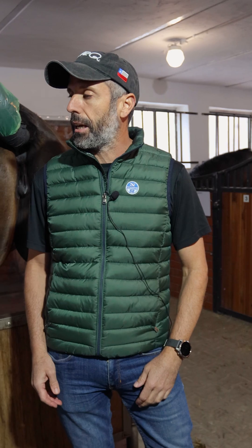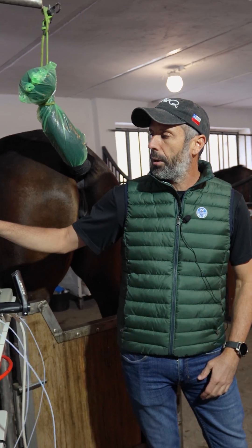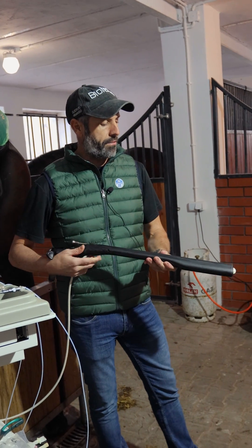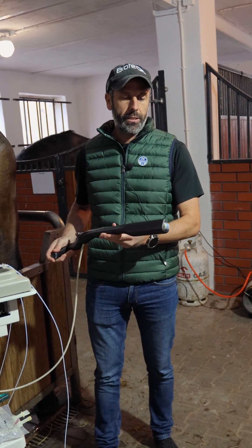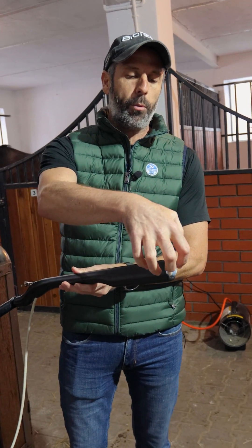I'm using it for the last year and I'm quite happy with the equipment. I've been using the blue scanner and they have two probes. The one we've just been doing now — we've spent five mares here in Poland. This is the probe designed for horses. The advantage of it is that it's a thicker tip of the probe, so you can fix better the ovary.